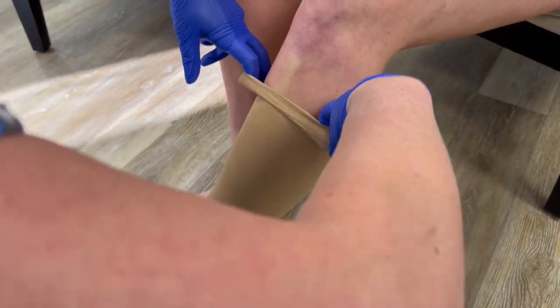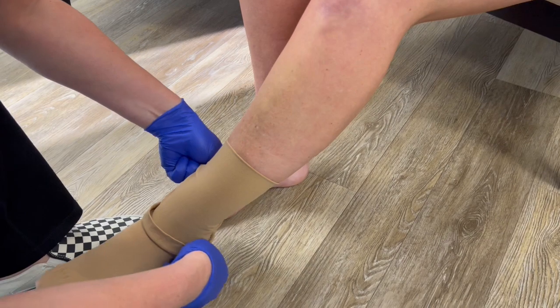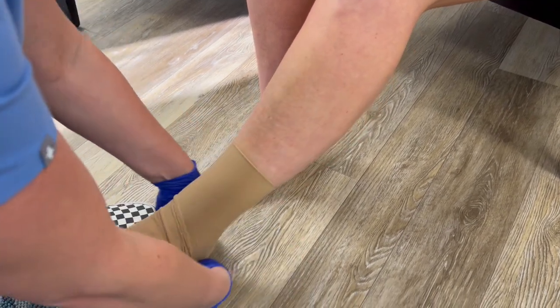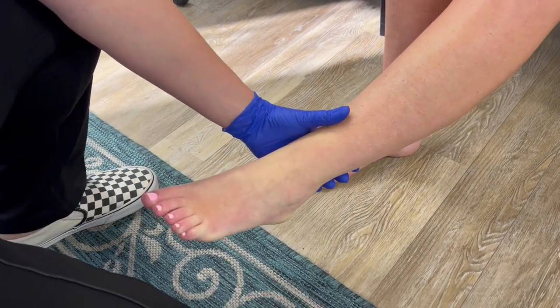Now we're going to show you how to take it off. You want to gently roll it down. The ankle or the heel is the hardest part here.